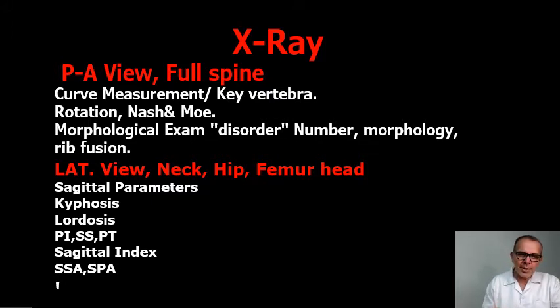All these parameters on the sagittal plane allow us not only to diagnose certain things, but to follow up on our treatment with bracing, with exercise, with whatever.